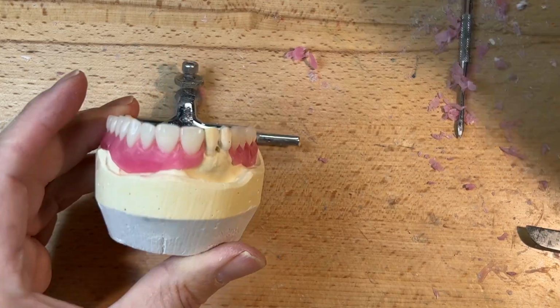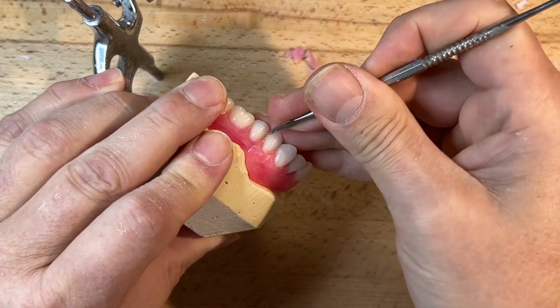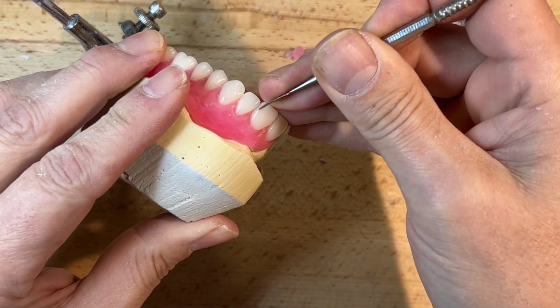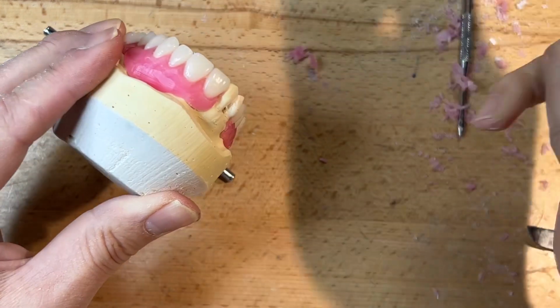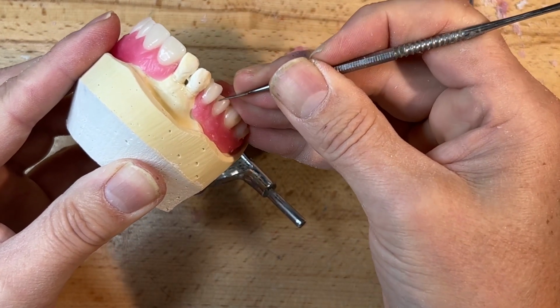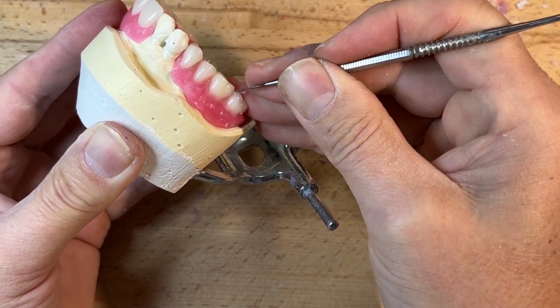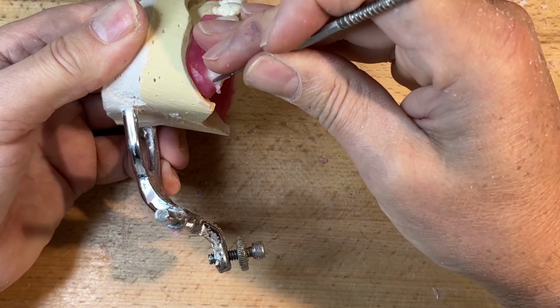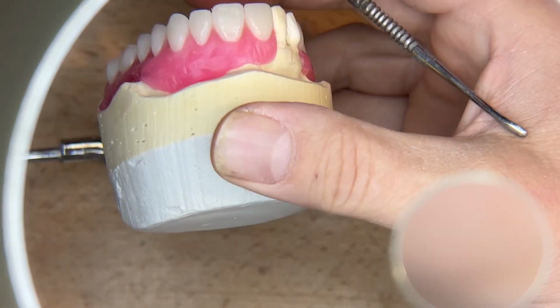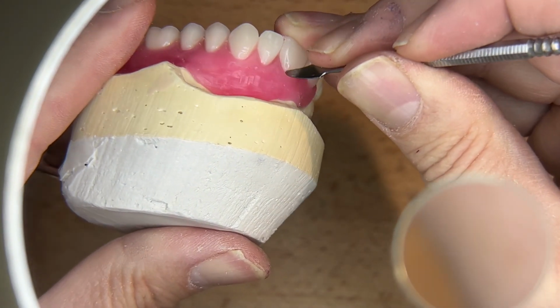What else do we have here? We could go to fine detail interproximally, whichever small carver you wish, just to make sure there's no wax up here on the incisal edge, and then reestablish these incisal embrasures, buccal embrasures, to give it that natural appearance. If we start filling these embrasures with wax and acrylic, we lose the natural appearance that we're trying to maintain. And if you want to go under magnification, we could do that, especially with someone with aging eyes like my own.